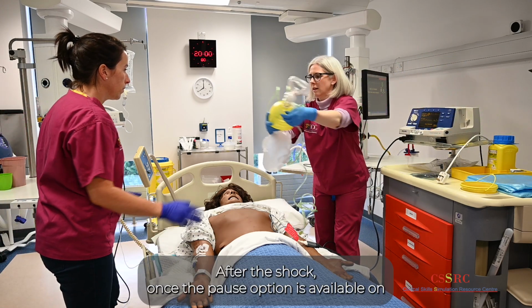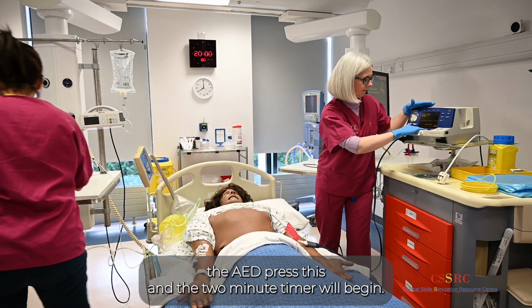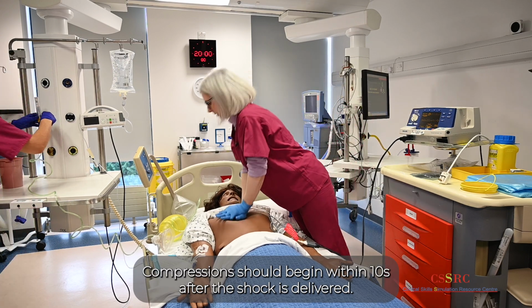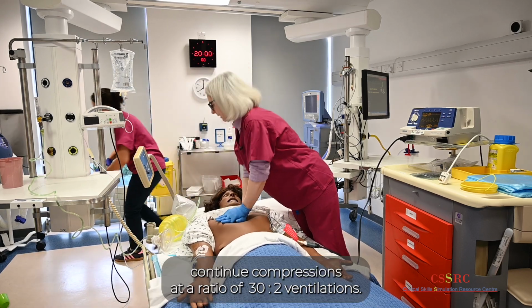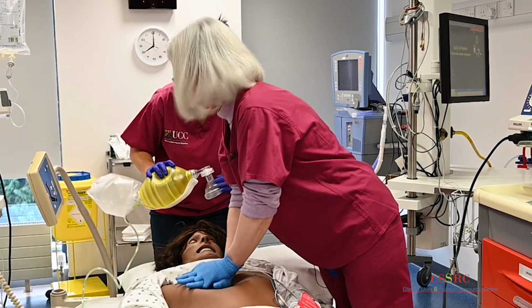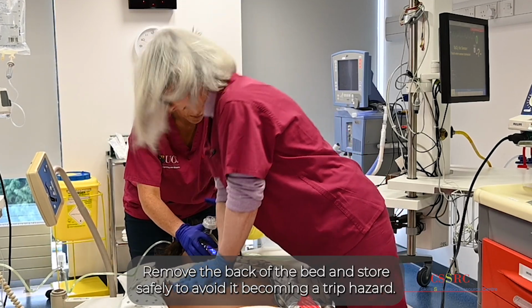After the shock, once the pause option is available on the AED, press this and the 2-minute timer will begin. Compressions should begin within 10 seconds after the shock is delivered. If 2 or more rescuers are present, continue compressions at a ratio of 30 to 2 ventilations. Remove the back of the bed and store safely to avoid it becoming a trip hazard.